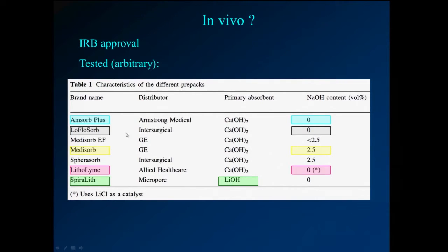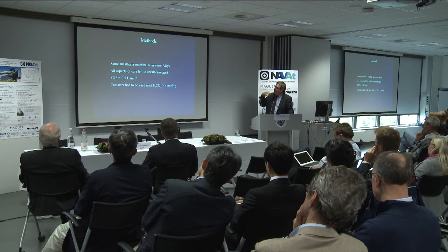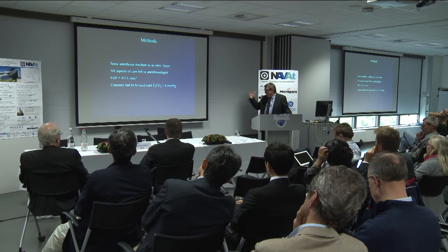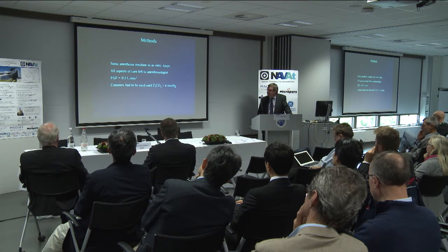So we tested 5 canisters, the Amsorb Plus, the low flow sorb, the Medisorb, and those two, somewhat arbitrarily, but I did happen to get 4 calcium hydroxide based canisters with different catalysts and the Spirolit. This is actually a study done by Karen de Jong. We used the same anesthesia machine as we used when we were testing in vitro with the different canisters, and we left all aspects of care to the anesthesiologist.